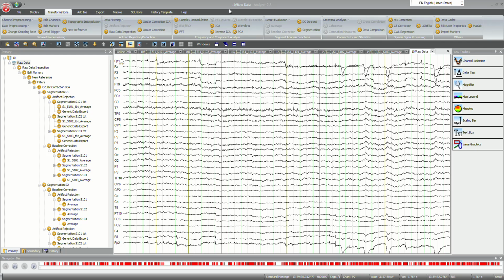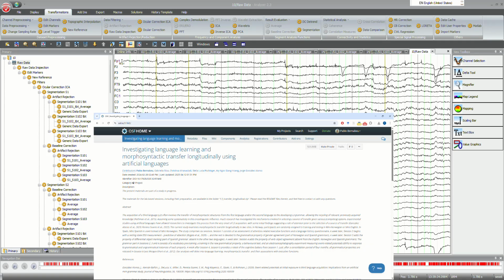They each have a certain meaning that is very important to reflect in a document from the design of the study, the implementation rather. And we're going to look exactly at that.